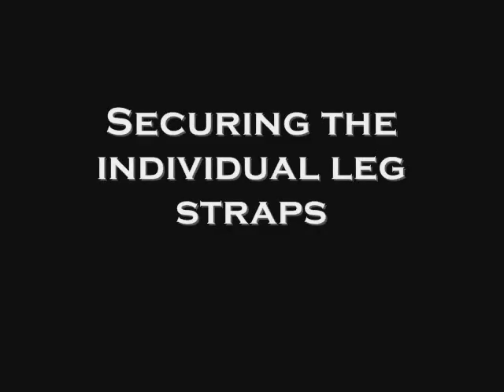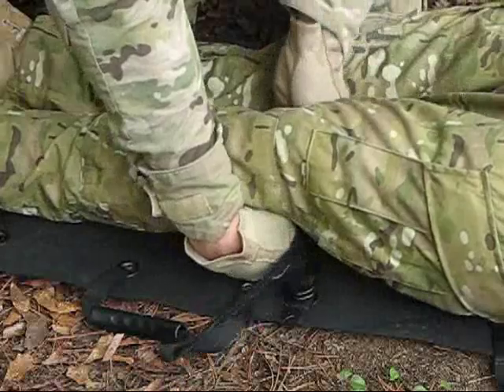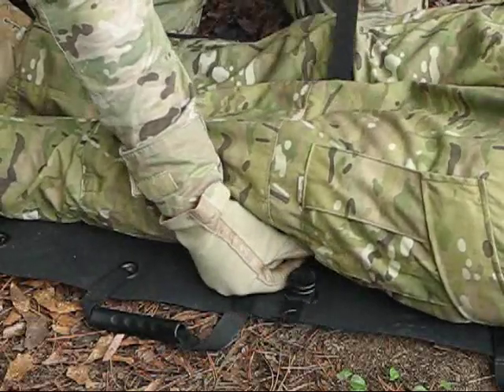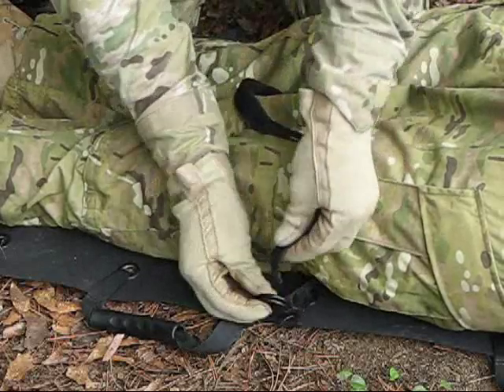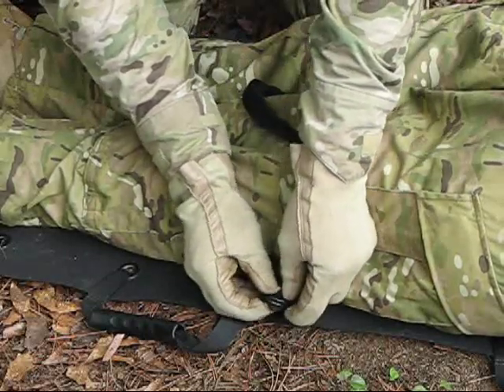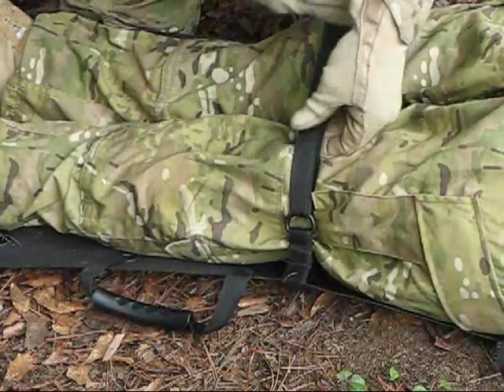Securing the individual leg straps. To use the individual leg straps, route the strap under the casualty's leg. Go around the leg and back through the D-ring. The strap can then be secured back on itself.